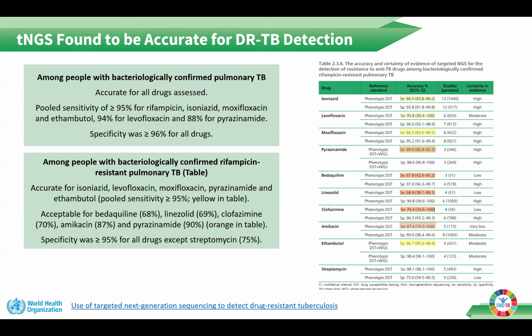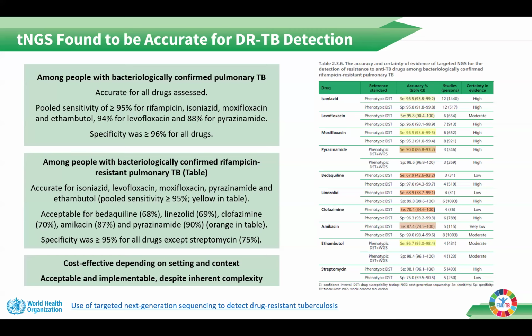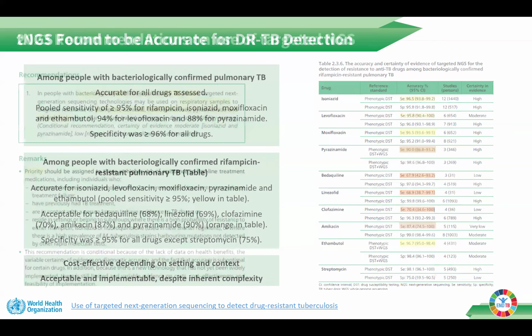Specificity was greater than or equal to 95% for all drugs except for streptomycin. And importantly, this was also found through systematic review of evidence to be cost-effective depending on the setting and the context, acceptable and implementable despite acknowledging the inherent complexity associated with the technology.